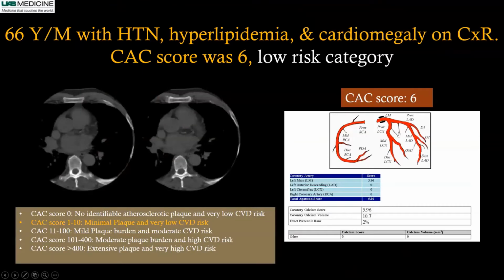All right. So as Dr. Bouchard mentioned, coronary artery calcification has a significant role in risk assessment. It has added value to the conventional clinical risk assessment. The calcium score is done by a non-contrast CT, and no special preparation is required. The scan is done within a few minutes, or actually within a few seconds, and then the machine software analyzes for any calcification in the coronary arteries with a threshold of more than 130 Hounsfield units.